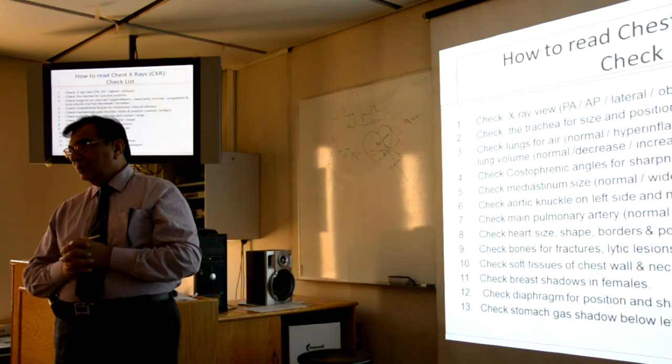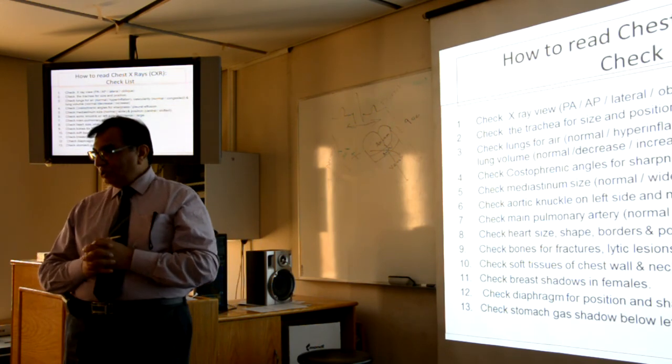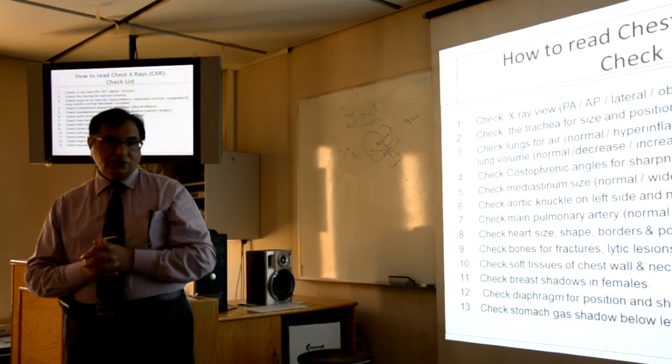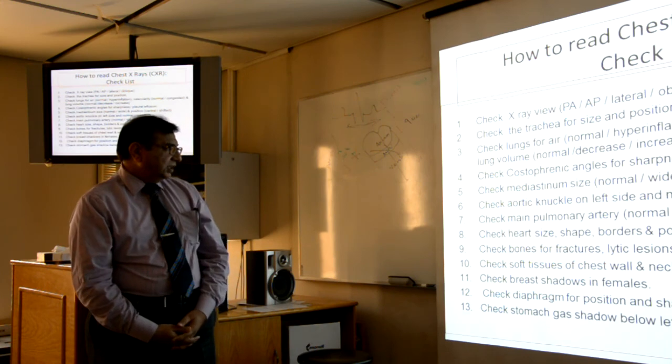Then next, you should not forget to check the ribs, the rib cage. Is it okay? Are there any erosions associated with the vascular abnormality, or any fractures, or any lytic lesions?